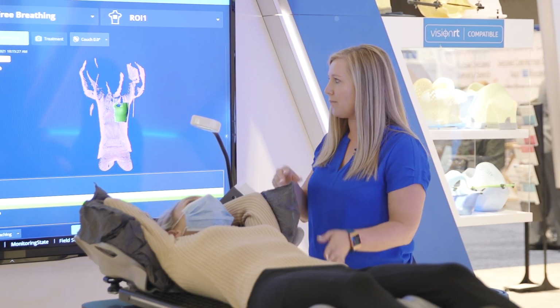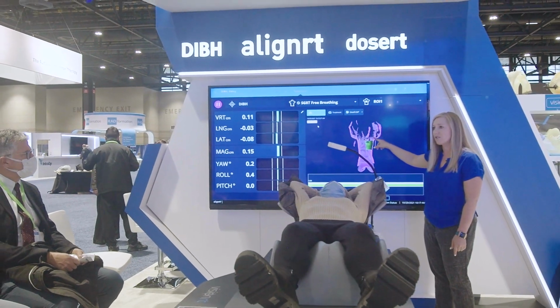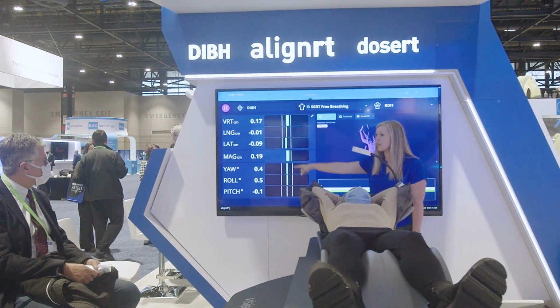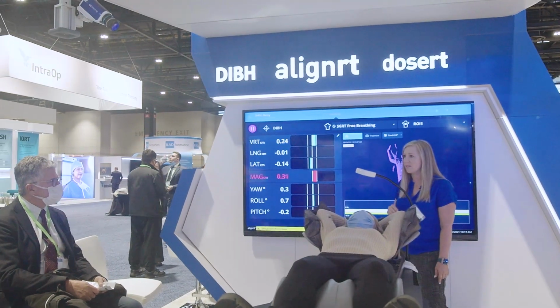exactly to that position. As you can see here, we have created a region of interest, which is over her left breast because that's what we're treating for her today. And over here, you can see we have gotten her in both her translations and her rotations set up perfectly to where she was in the sim.